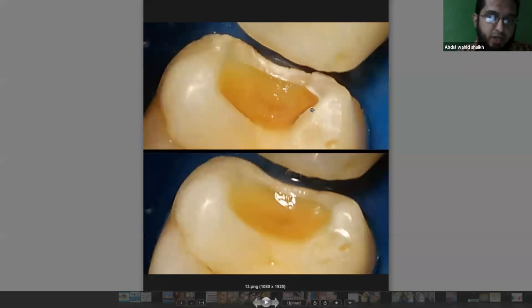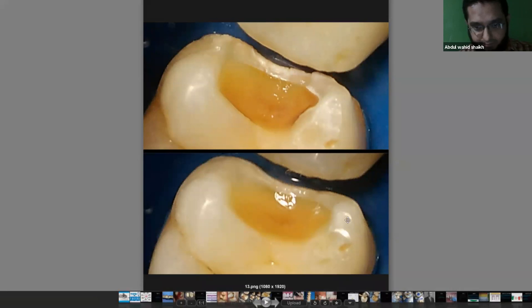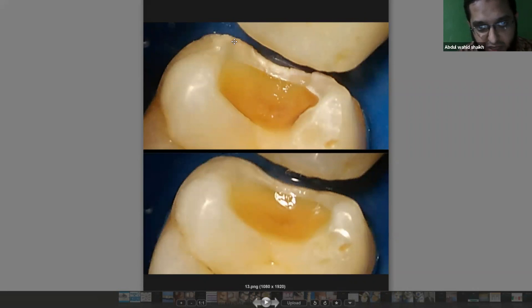We don't want a demineralized dentino-enamel junction — you can see clearly here the DEJ is demineralized. We also want all line angles and cavity outlines to be flared, smooth, and rounded. In the gingival seat area where it's difficult to clean with a bur, I use proximal abrasive strips — the same ones used for composite finishing — to easily make it smooth.